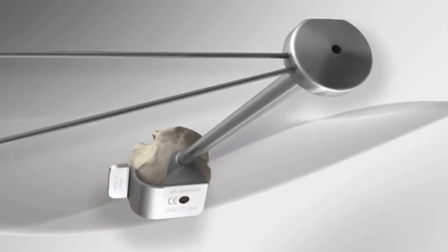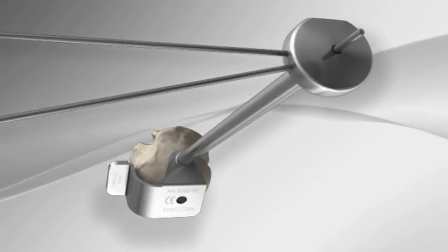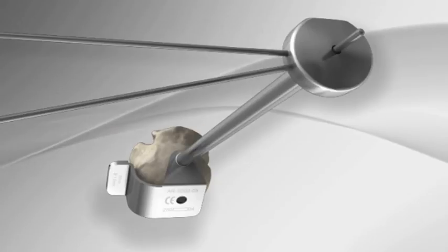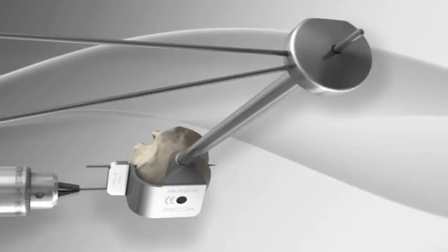A cutting guide is placed on top of the humeral head. A guide wire is then placed into the bone through the guide to prevent slippage. Two pins are then drilled into the humeral head through the guide to determine alignment of the cut.